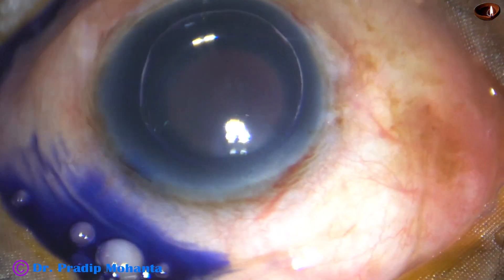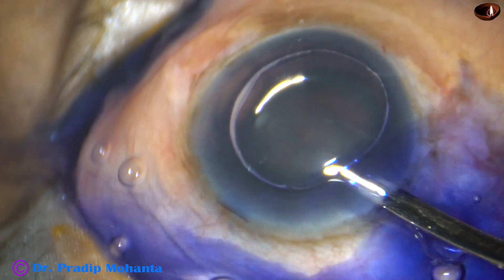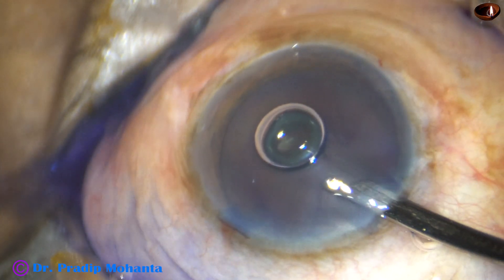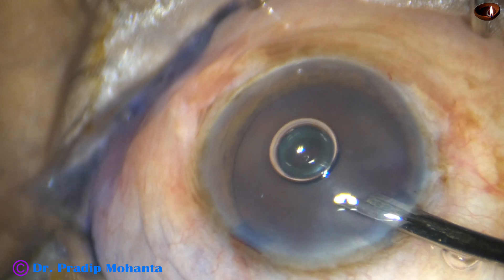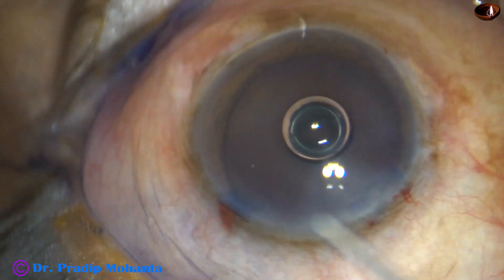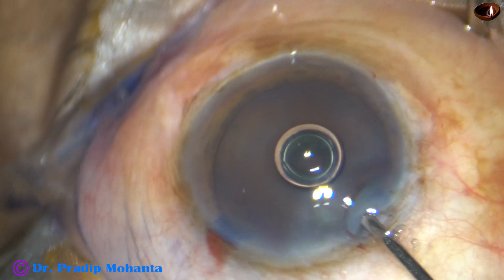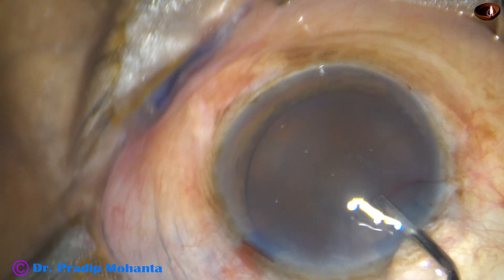The dye is washed out after just 6-7 seconds. And now, 2% hydroxypropylmethylcellulose is injected into the anterior chamber.